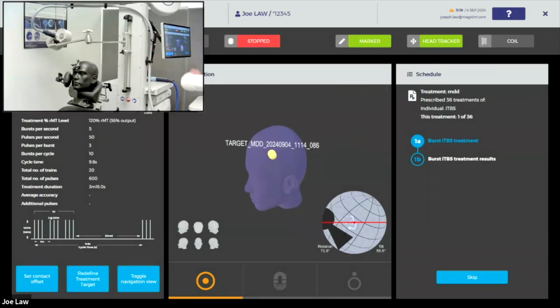So this gimbal down here is going to guide us with regards to the tilt, rotation, and the yaw. The way that works is this black bat icon needs to be within this red line, and that's within tolerance. It'll be a bit easier if I show you, which I will in a minute. So once this is green, it'll be within the right location. Once this is green, it'll be in the right orientation. We'll then have a full green box around the outside of the system to tell us all parameters are within tolerance and you're able to treat.